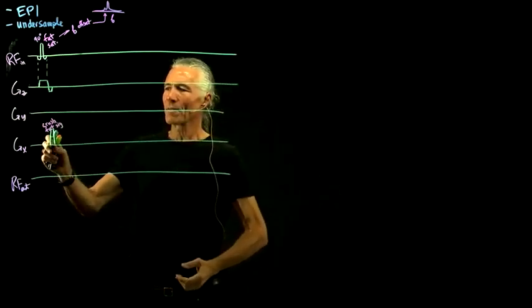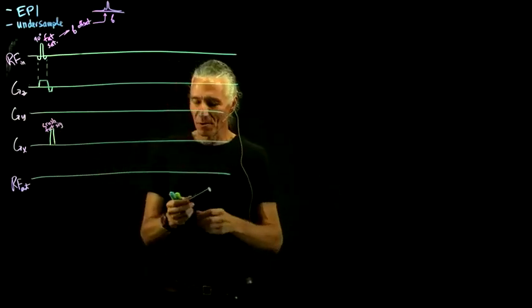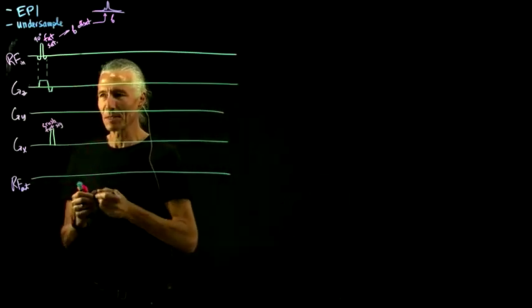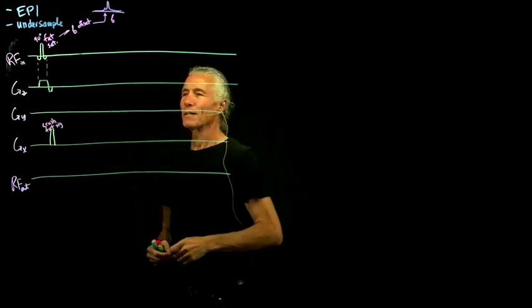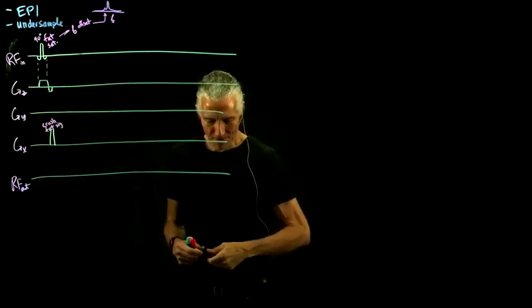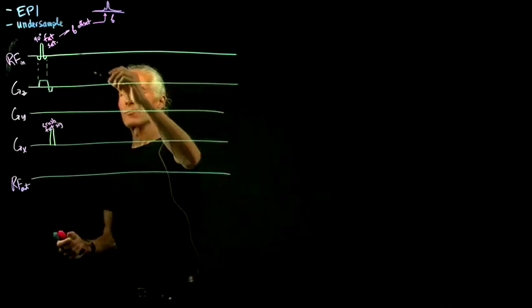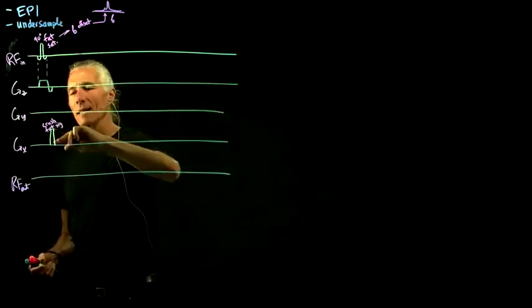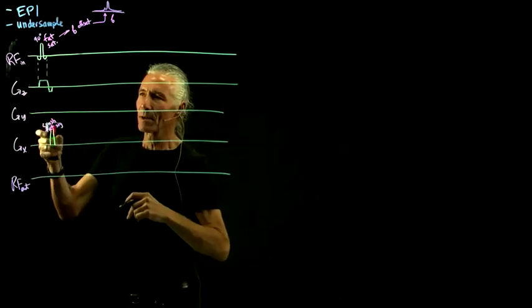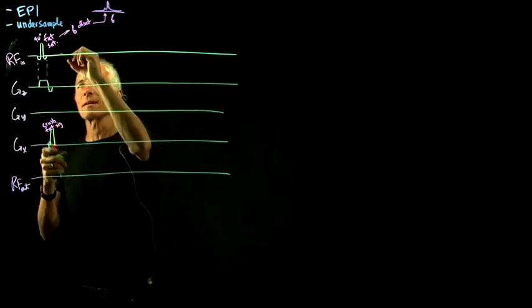So we wrap it up into 512 stripes, which is almost no signal. So that's the fat crusher. And that doesn't take very long, because we make a signal, but then we can quickly hammer it to make it go away.